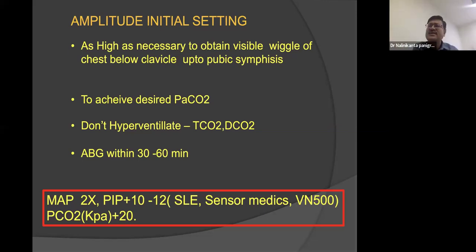If the disadvantage starts, air trapping and retention of carbon dioxide happen again, and a lot of injury to the lung starts after that. So if you are really increasing the delta P to get more ventilation beyond 3 times the mean airway pressure, revise the mean airway pressure, revise the TI, revise the frequency once again. Look, is there a block in the ET tube? Are secretions blocking? Is there an issue in the circuit? Clinical reassessment is important if you are crossing more than 3 times.